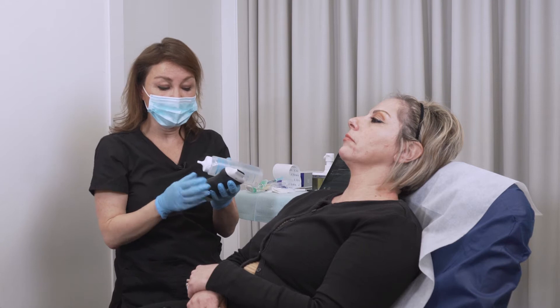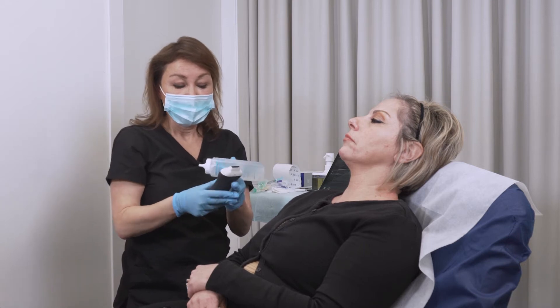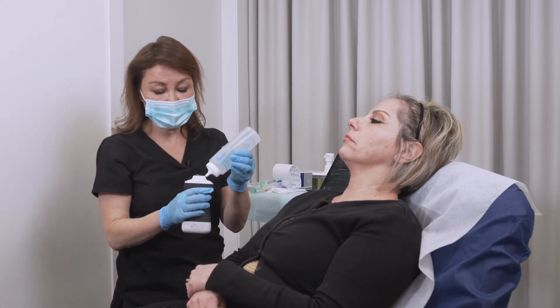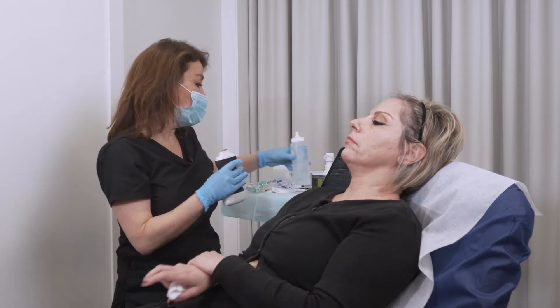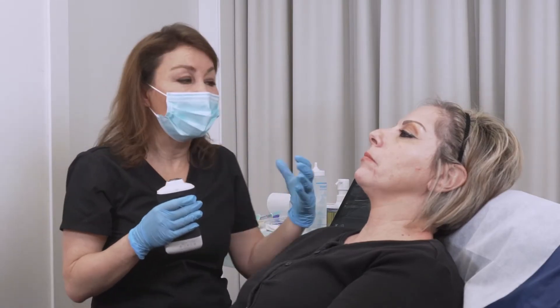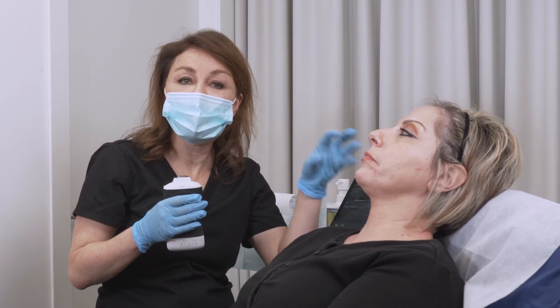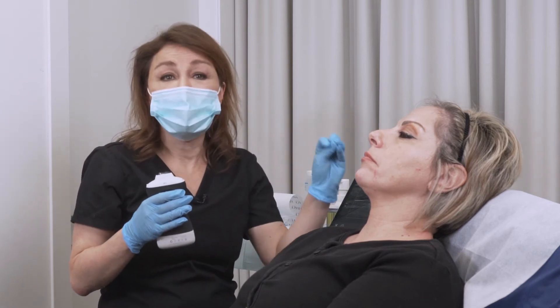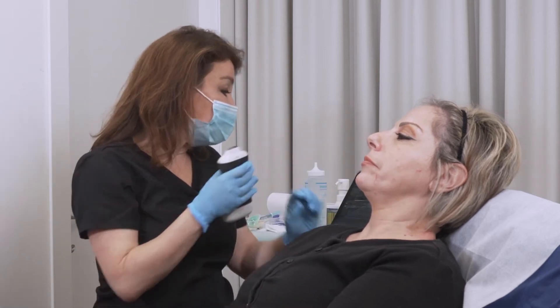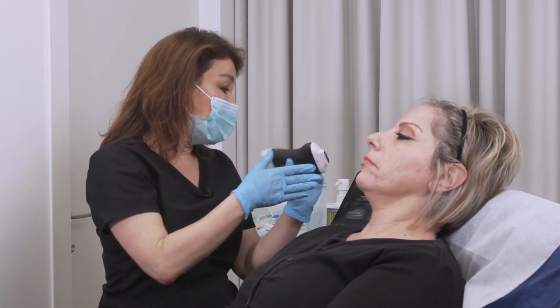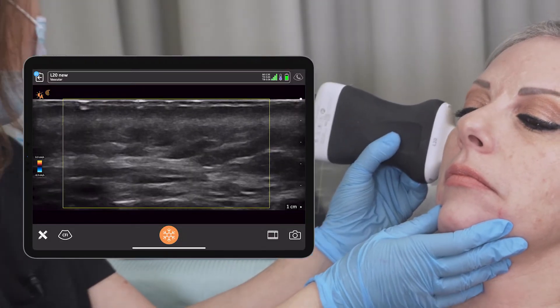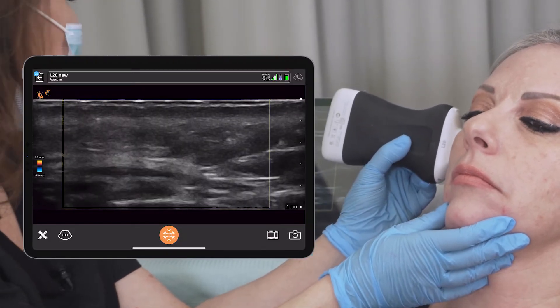On the lateral parts of her cheeks, it's not a danger zone, and there are no known vessels that we can hit when we inject the lateral cheek on top of the bone. We can check, and I can actually see there are no bigger vessels there.